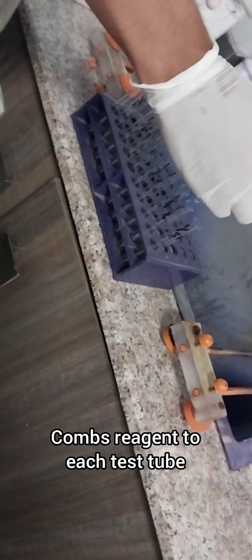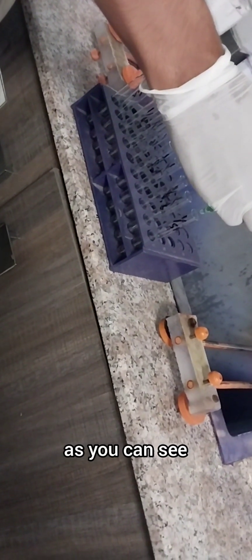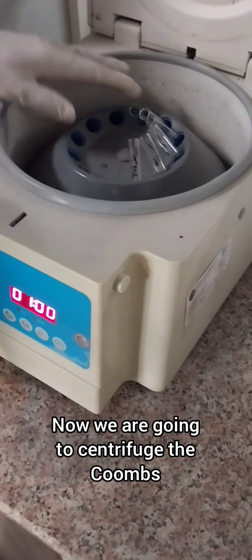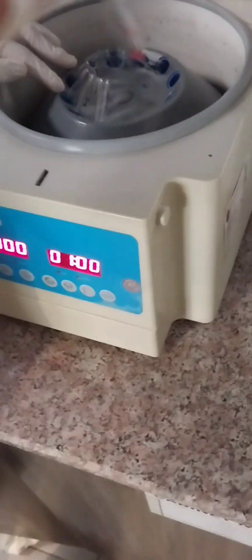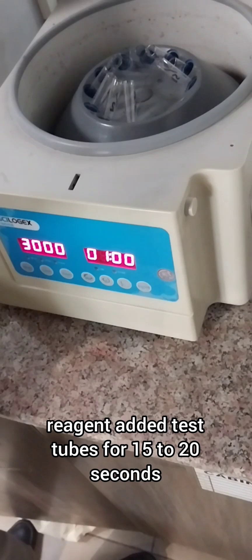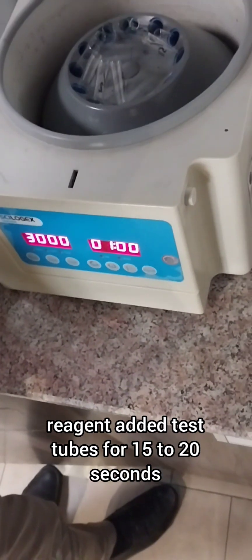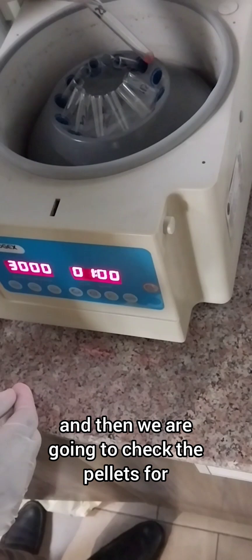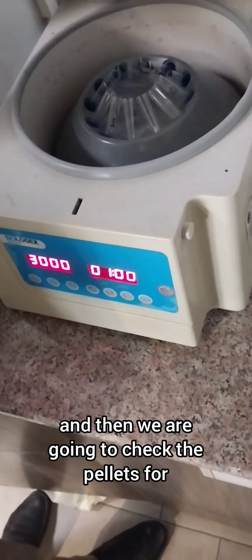Now we are going to centrifuge the Coombs reagent added test tubes for 15 to 20 seconds at 3400 rpm again. Then we are going to check the pellets for agglutination. This is the last step.